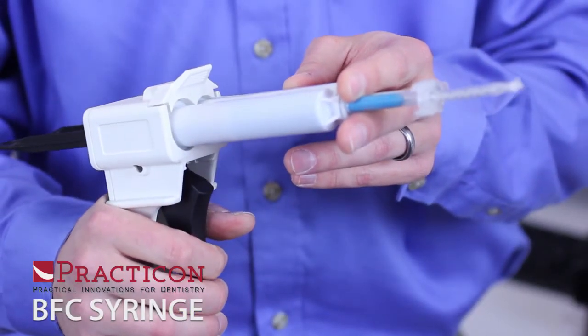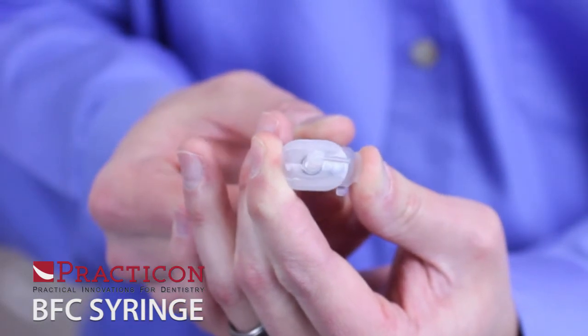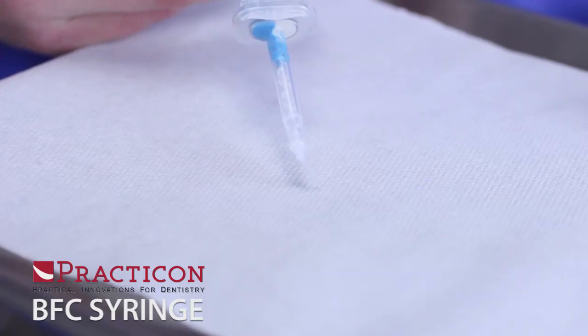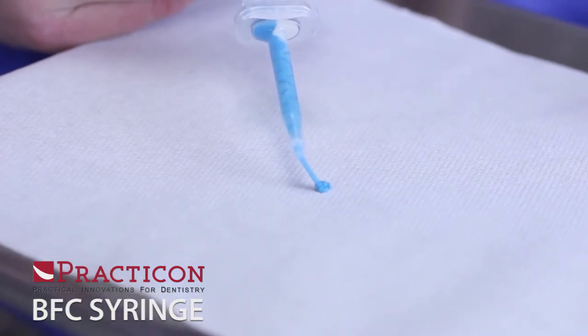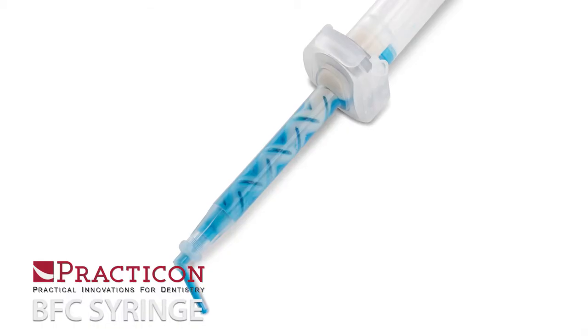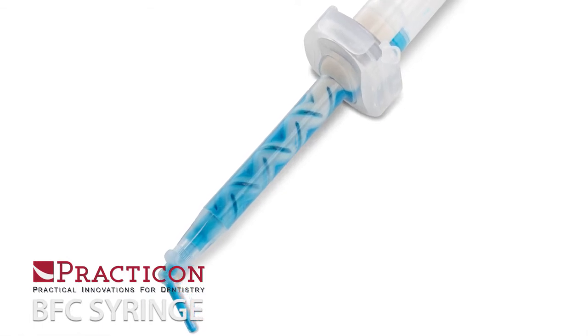Just express your favorite material into the syringe, insert the plunger, and slide the top to seal. Preloadable BFC syringes can be stored for later use or used right away. BFC syringes are easy to maneuver in tight spaces and cost less than standard mixing tips, even when you factor in material cost.